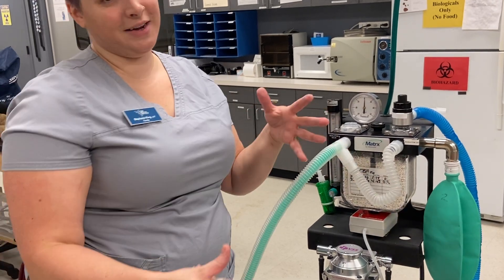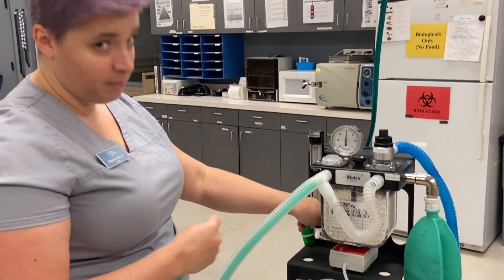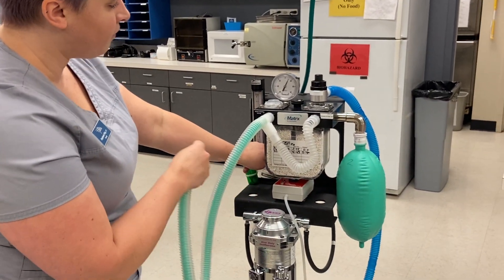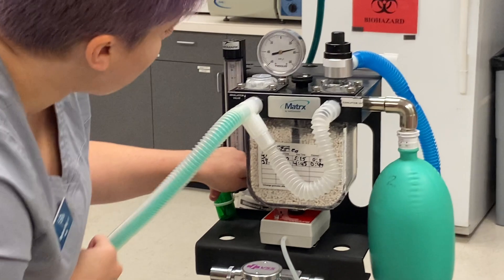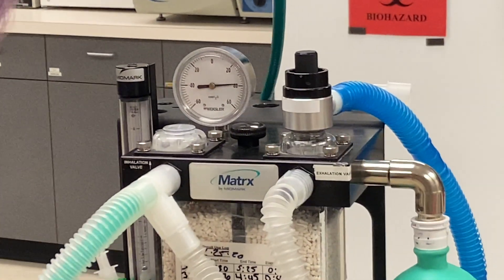Remember that your bag needs to fill up first — especially if you have a really big patient and you have like a five-liter bag, it can take a while. So don't panic. You may have hooked everything up just fine. Just hold it, watch your bag fill, and then it starts to move. Go ahead and get to just about 40 on the manometer and hold it nice and tight and watch it.